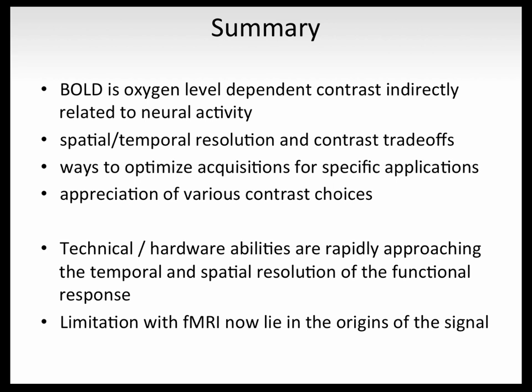Also, I think that with the advances in the hardware, technical, software and reconstruction abilities, we're basically approaching the ability to acquire fMRI scans at a pretty high temporal and spatial resolution. And now we just have to figure out exactly where the origins of the fMRI signal are to get the most out of this technique, and hopefully it can then be much more useful clinically.